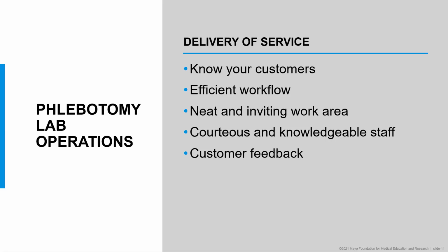To provide smooth operation in terms of services, you need to look at your workflow. If you want to design an efficient workflow, you want to make sure that you remove all the waste within your system, and that will allow you to have a seamless operation from end to end. For any work area, having a continuous improvement team to look at how we are delivering the service, from the time that the order is placed to the time that we send the specimen to the testing lab, is very helpful.